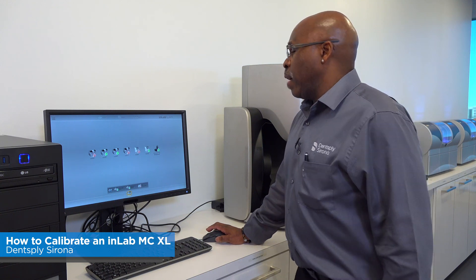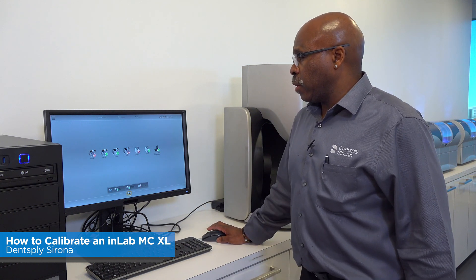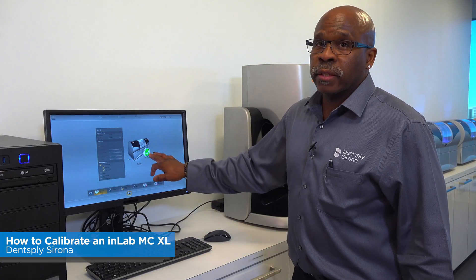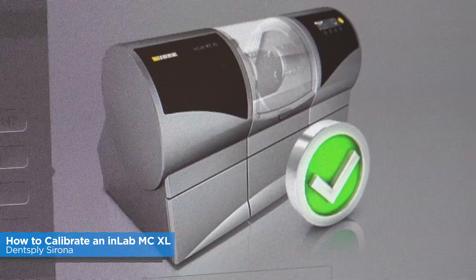Once that's open, if you have multiple milling units, they'll be displayed on the screen. Pick the milling unit that you're getting ready to calibrate. Make sure you have the green check — that means you're communicating with your milling unit. Then go to Calibration.